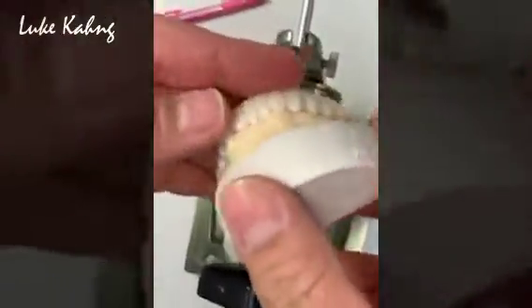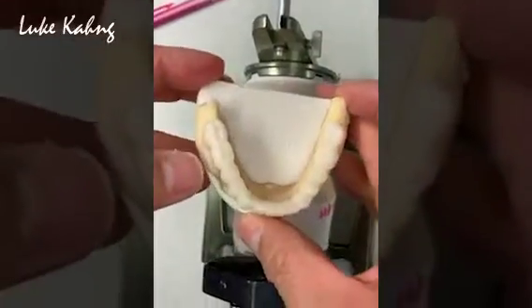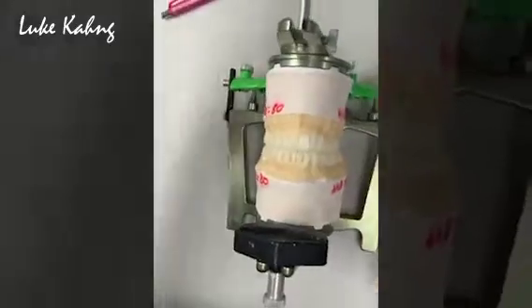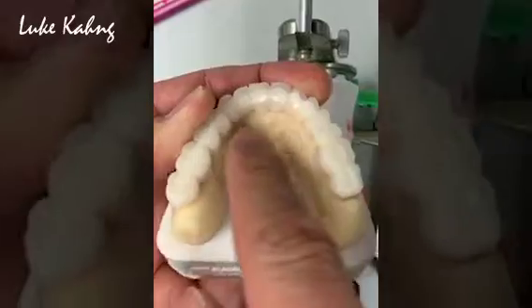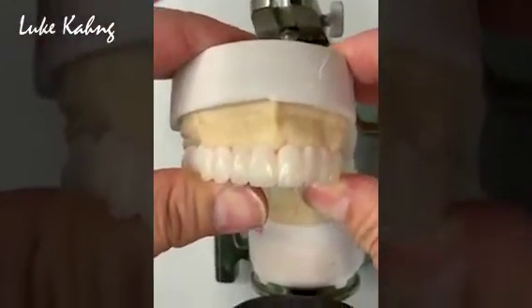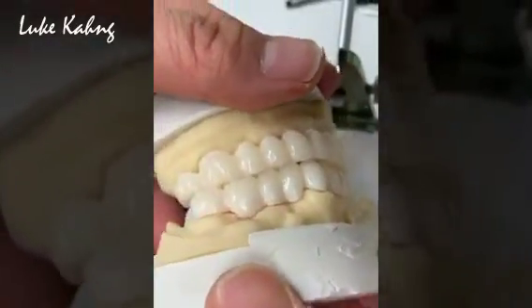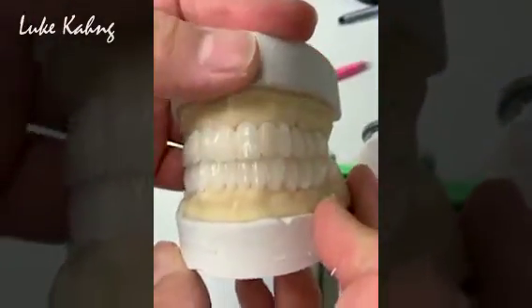So we made this from the treatment plan wax-up, and then we finished it — trying to increase width as much as possible from an aesthetic standpoint. All fiber core underneath. Here's the upper as well — put all the fiber core in, just to make sure of the protection. The most important things are aesthetics and occlusion. That was the very important concept — everybody's looking for a full smile and they have to chew properly. They have to chew properly in order to match these beautiful restorations.